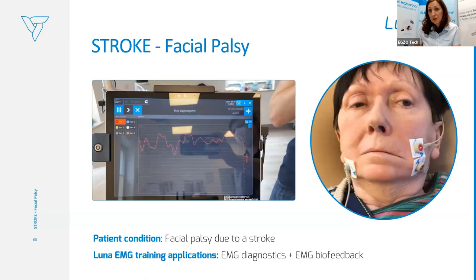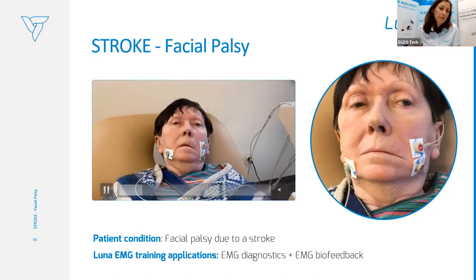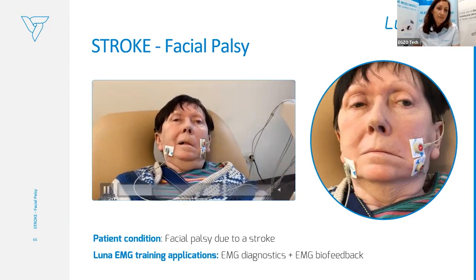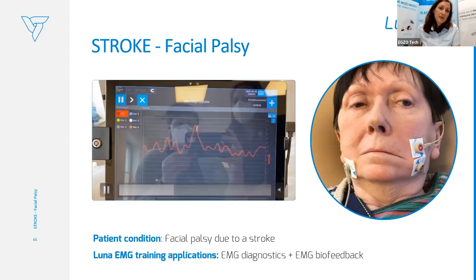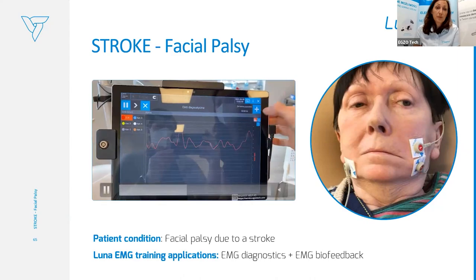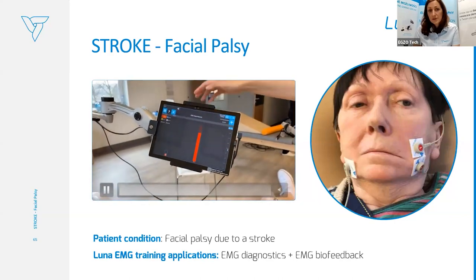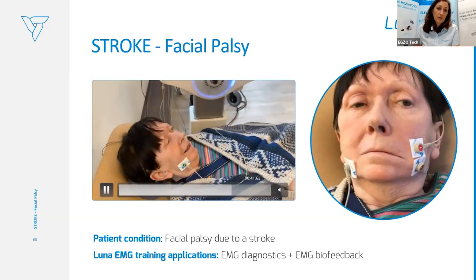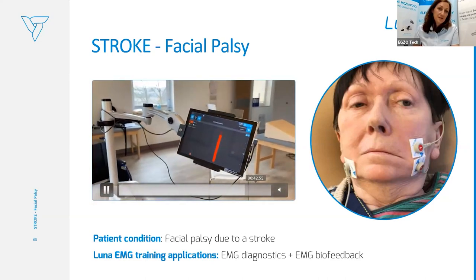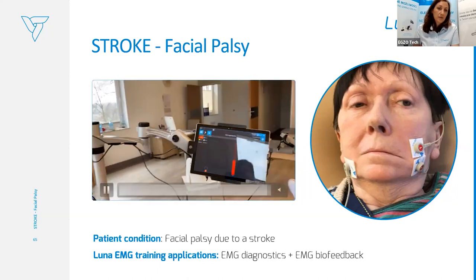Another example of using Luna EMG for stroke patients is facial palsy. The patient after stroke with facial palsy — we worked with EMG biofeedback and EMG diagnostics with real-time EMG view so the patient could see where the muscle is, how to contract, whether it can be activated. The patient was trying to contract for some seconds, keeping the contraction to make it stronger in the EMG biofeedback program. As you can see on the video, there is also a very positive reaction toward the device, really influencing motivation.